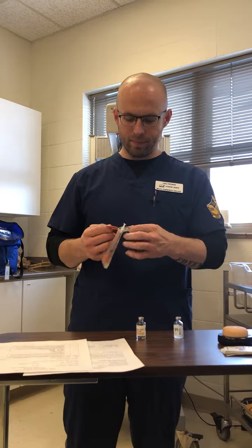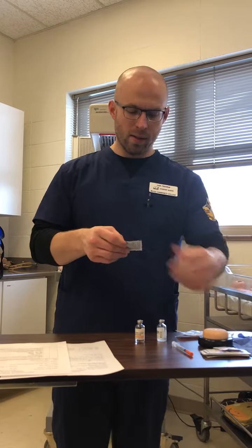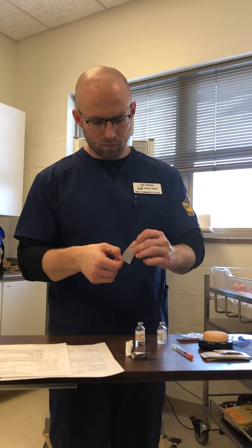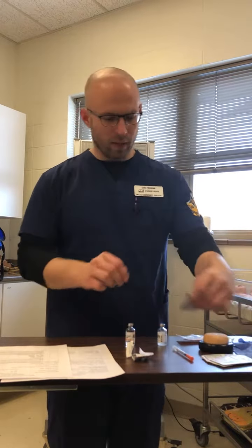We're going to make sure we have the right needle, a U100 insulin syringe. These vials are already open, but we have verified that they are not old by checking the time and date that they were opened. We're going to start by opening an alcohol pad and wiping the top of both vials.